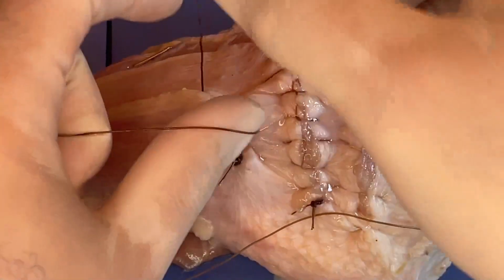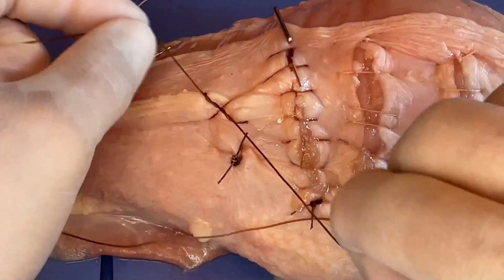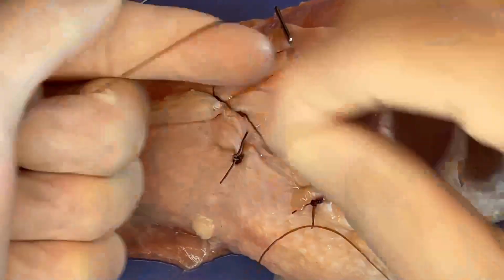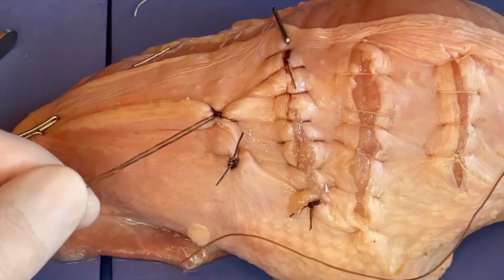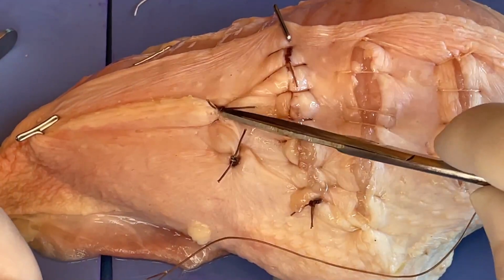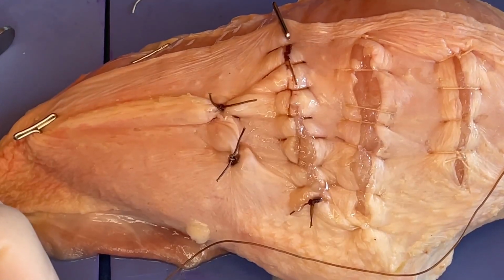And then again, I'm going to do over the thumb once, twice for our surgeon's knot, and just a slow, steady cinch that down, and then over finger, come back over thumb. So that's 3 throws, 1.5 square knots. That's appropriate for chromic. Cut that. And again, you can see how it just really bunches up all of that tissue. So that's our figure of 8.